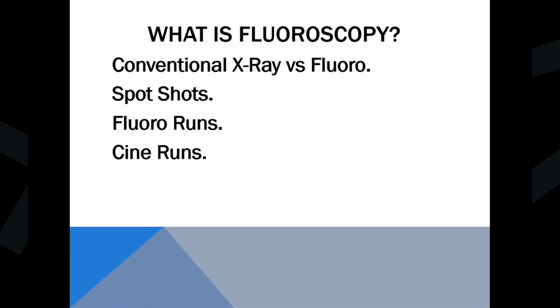So then it's stored in a digital recording device, and then whoever the clinician is can go back and look at the actual runs like you would real time, like TV. So we'll get a little farther in here.